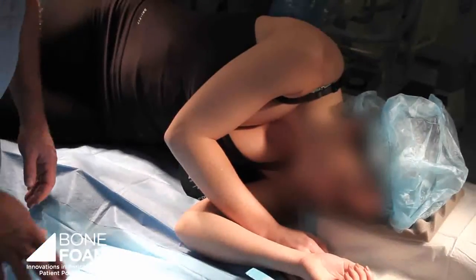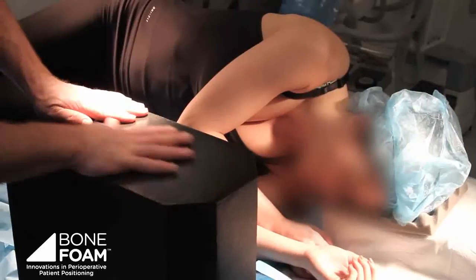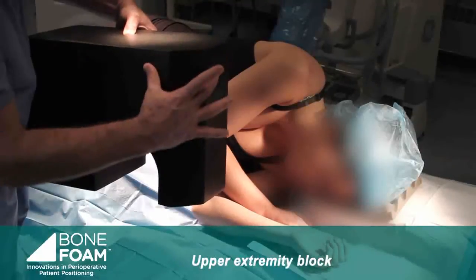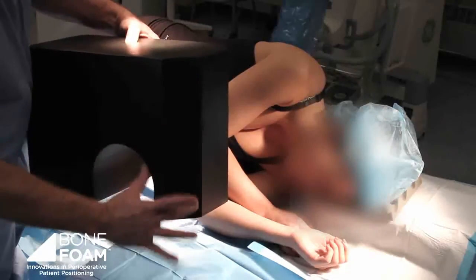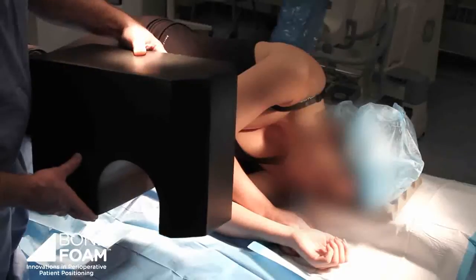So this is the first bone foam upper extremity piece that I'm going to demonstrate. You can see that there's an offset tunnel and the narrow side goes up toward the head of the patient. It's narrower so that it won't be in the way of the endotracheal tube or in the way of the face, which allows for anesthesia to access the patient's airway.